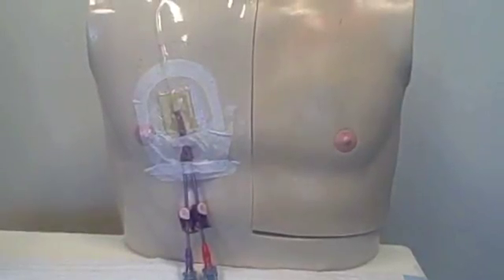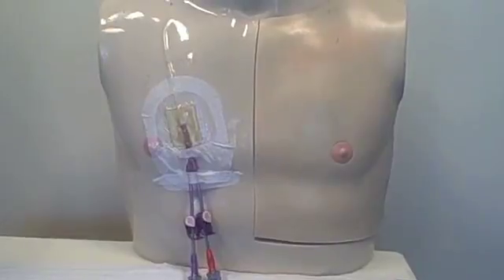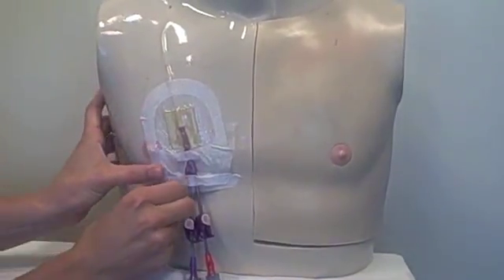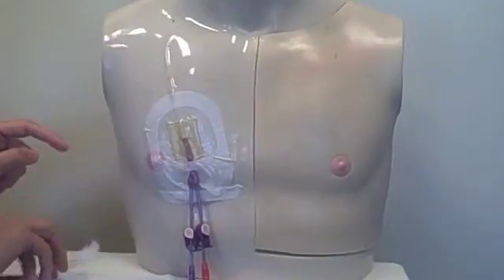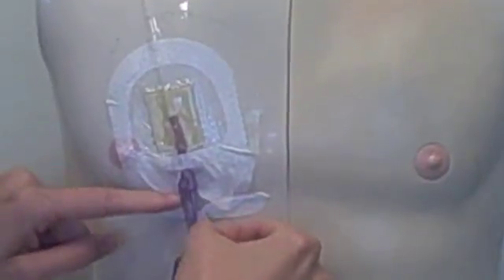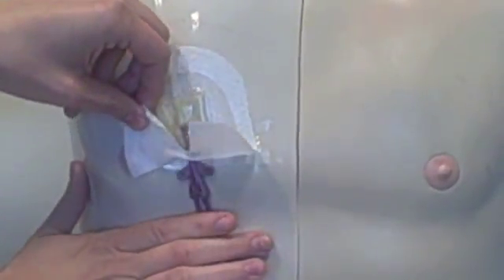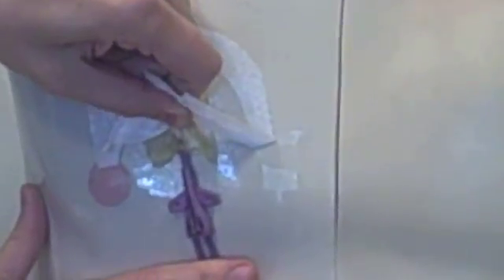The dressing on the insertion site must be changed once a week or whenever it becomes loose. Gently remove the old dressing by peeling the dressing up from the bottom towards the insertion site. Work low and slow, peeling the dressing back onto itself. Prevent the gel pad from separating from the film by placing a thumb and forefinger on the gel pad while removing the dressing. Once the dressing is removed, you may discard it.